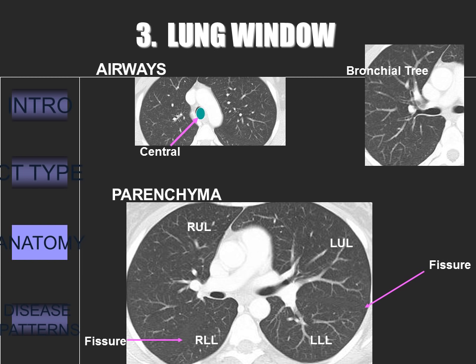Last, we'll look at the lung parenchyma — do it by lobes. Try to find the fissure lines, which are either well-demarcated black lines or simply avascular lines. Start with the right upper lobe, then the right middle lobe, then the right lower lobe, and repeat this for the left lung. The radiologist will often be looking for nodules — tiny white flecks amongst a sea of other white flecks. Follow the vessels: if the white flecks move, this is a vessel. If they do not move on three consecutive slices, you can be sure there is a 3D structure and not just contrast within the vessels.